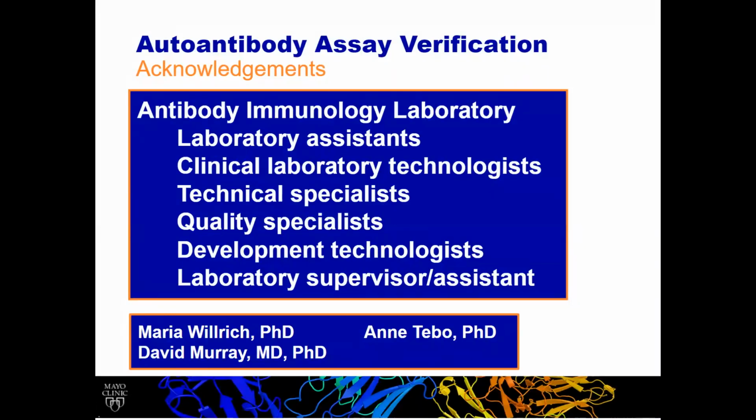There are some others that we sometimes do. Stability could be one. Sometimes we do specificity testing to make sure we're detecting the appropriate antigen specificity, if there are related antigens that we could be having crossover between. So those are just a couple of the things we'll think about whenever we're making verification plans for an assay, above and beyond what our regulatory requirements would be.